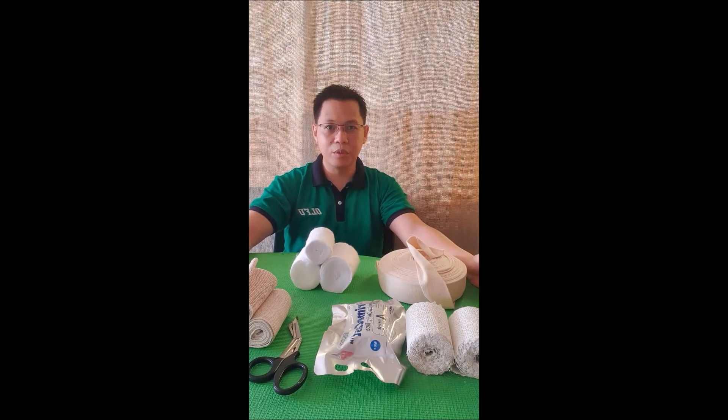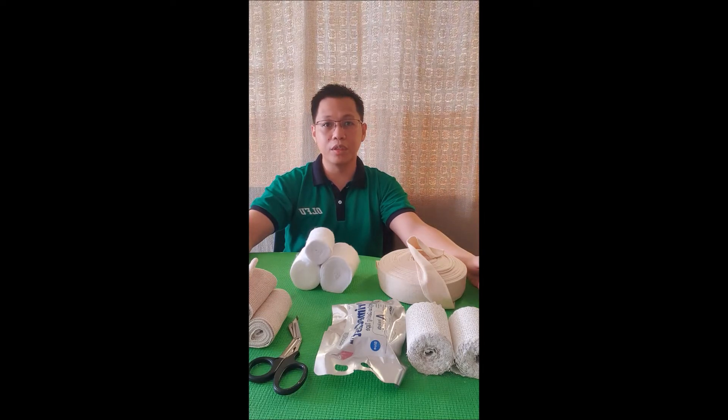Good day. Today we will be demonstrating the proper way of application of a long arm posterior mold. A long arm posterior mold will be very useful in certain situations, like when you are about to transport the patient to a hospital facility, or when you are awaiting definitive treatment for the patient. This is a temporary immobilization.